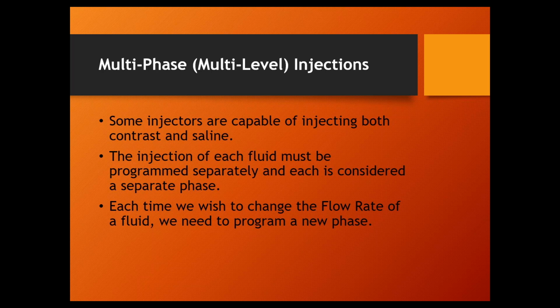Because we buy our contrast injectors that we use for training used, we always get them with all the protocols stored in memory, so I can see them. I've never opened up a protocol stored in memory that we've gotten from a real hospital and it was just a single phase. It's always 2, 3, or 4 phase shots all the time.